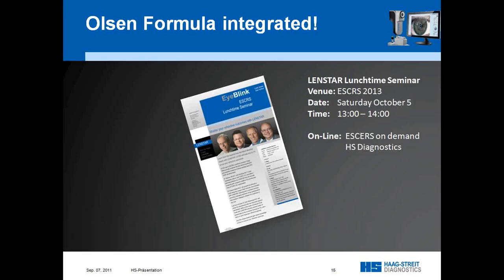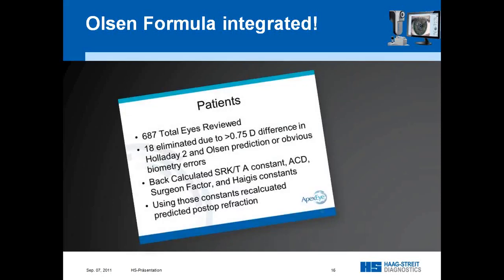And in there we have different talks, and one talk focuses actually on the refractive outcome of Olsen. Let me quickly provide you with a wrap-up of this talk. It's a study done on almost 700 eyes where the outcome of different IOL calculation formulae were compared.